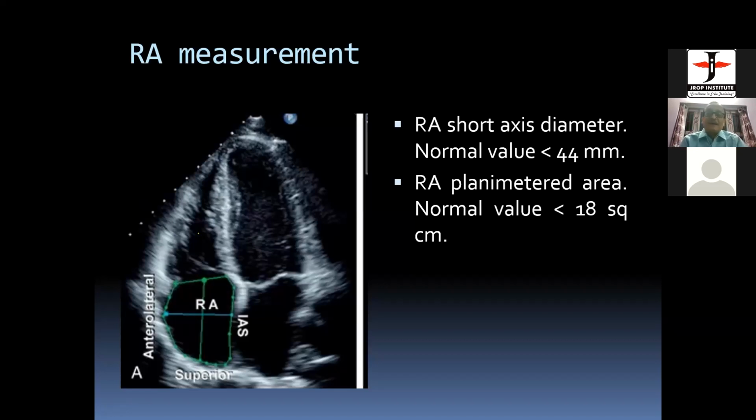That gradient. I don't have a slide here, sir, because it was not part of the discussion. I'll show you dP/dt next week, just make me remember. It is most commonly used for mitral regurgitation, and I'll show you how to measure it. Okay? Any other question? No, sir.